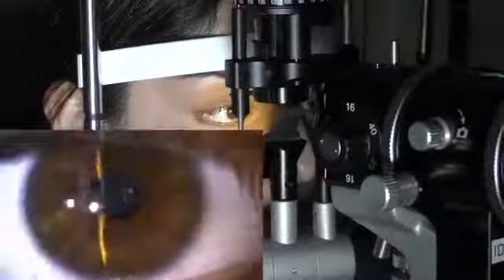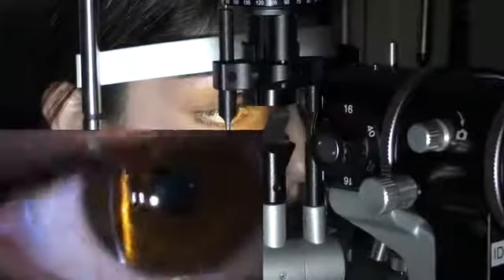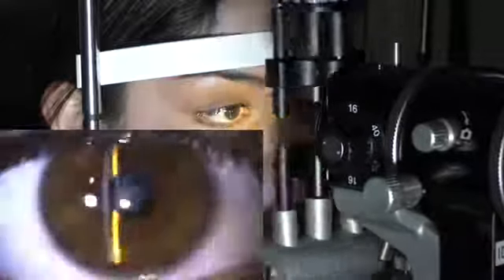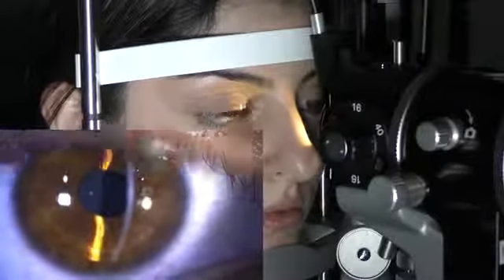So then move across again. Look centrally at how deep it is. You can see it's nice and deep in the center here. And again, the periphery over here is also nice and deep. And we're going to move to the center here. And next, we're going to look at the anterior chamber.